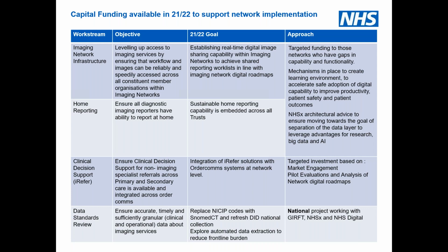So specific, tailored, local requests for potentially additional home reporting stations or additional VPN servers, or sharing infrastructure or VNAs or whatever it is, we have asked the local systems to tell us what they need, and we will allocate funding to those proposals, hopefully very shortly now.